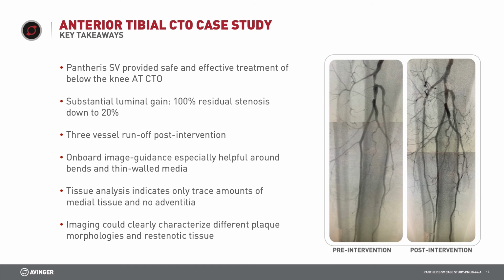Not really risking going too deep or getting a device stuck because we were watching what we were cutting out the entire time. And the patient had obviously great pulses at the end, and subsequent to this, I can tell you that he's been able to heal his wounds. He's had a great outcome. Hopefully at the next meeting, I'll be able to come back with 1 year patency data on this single patient, which obviously won't be very robust from a statistical standpoint, but from a good summary, anecdotal standpoint, I think that'll be a powerful piece of information to pass on.